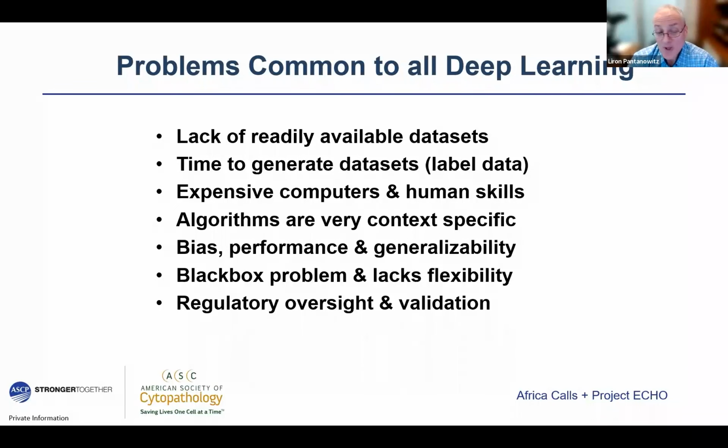Some of the complaints people have now is that algorithms are biased, especially if you build them in, say, the USA, on just one group of patients. Will that be applicable to patients in Africa? I don't know. How do we evaluate the performance of these algorithms? And will they be generalizable? In other words, if an algorithm is built by a research company in partnership with one lab, can they generalize it and plug it into your lab?